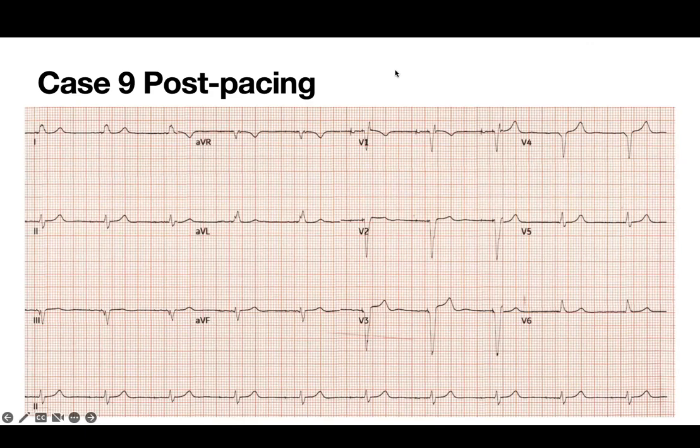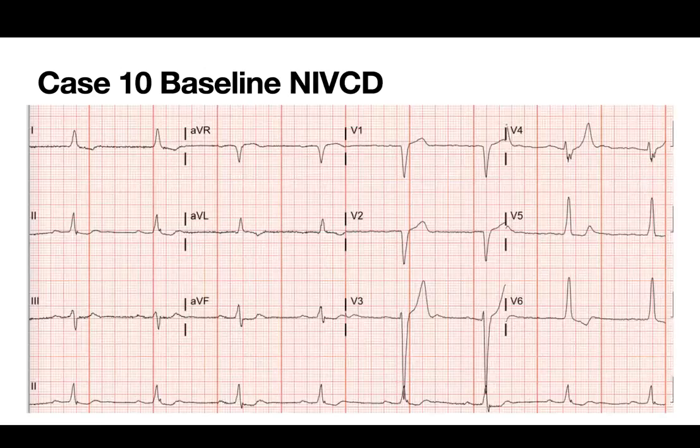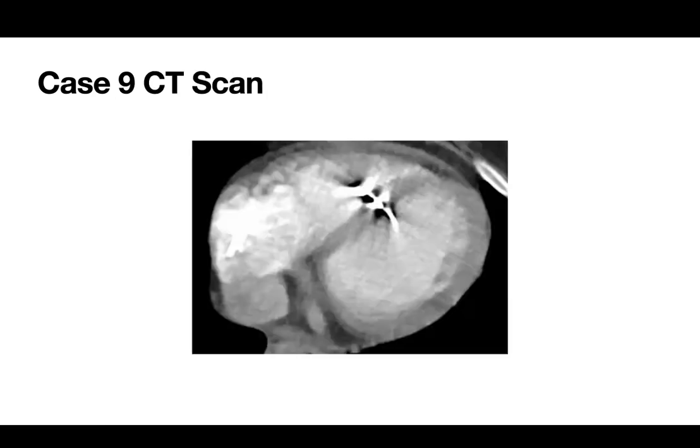So I knew the anode wasn't in, but because the septum wasn't very thick, I left it like this. Then the patient had a CT for another reason. Can you go on to the next slide? I need to show all the clips of the CT, but I just showed an illustrative one. This is artifact over here, but the anode is not in; it was in about halfway into the septum, or maybe 3/4 of the way. It could have gone in a couple more millimeters probably, based on what I saw on the CT.